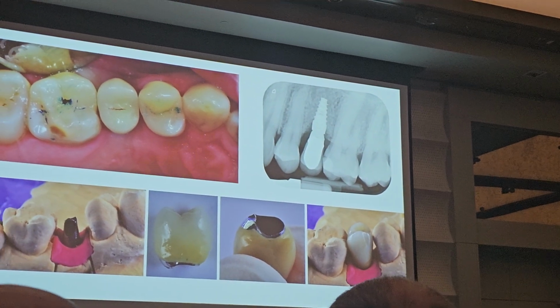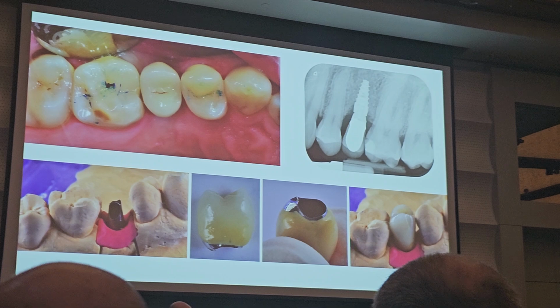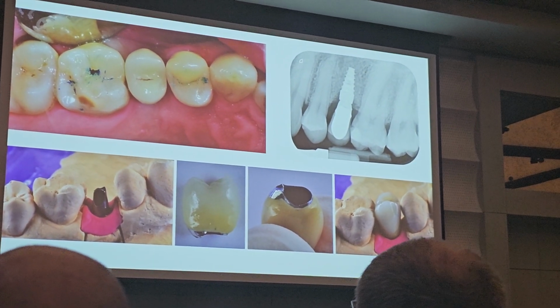When you do metal ceramics, always create some step for the hammer. Do not forget. Otherwise, you will not be able to remove the crown anymore, if you need to.